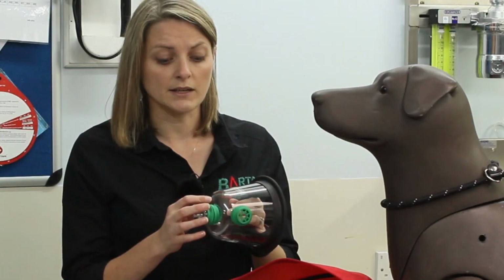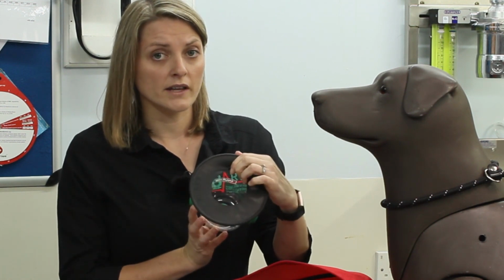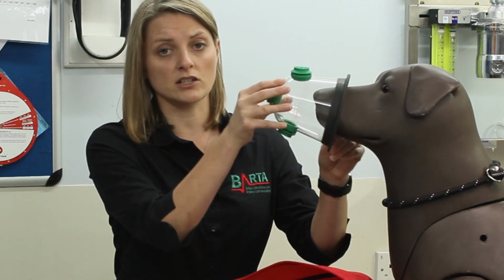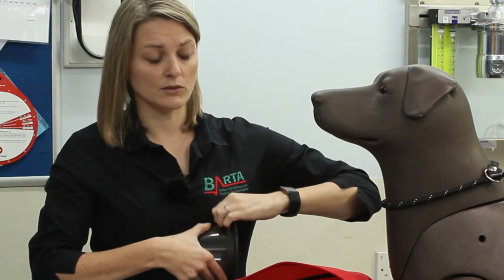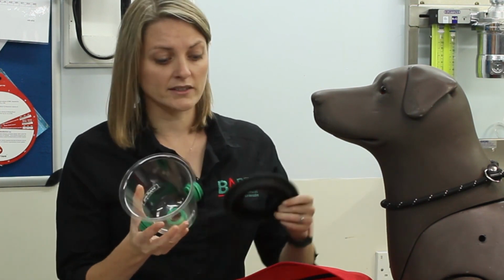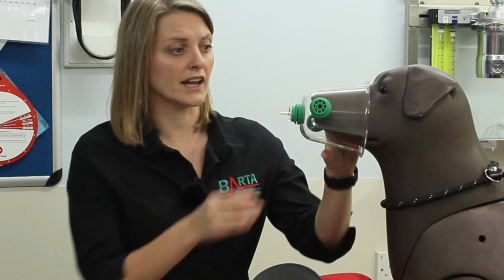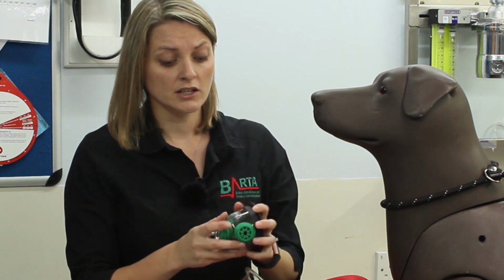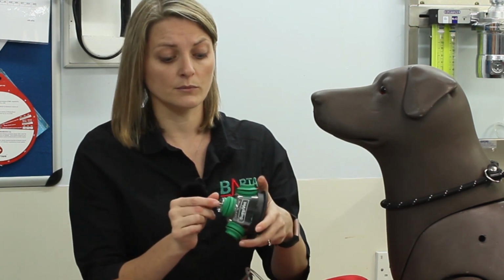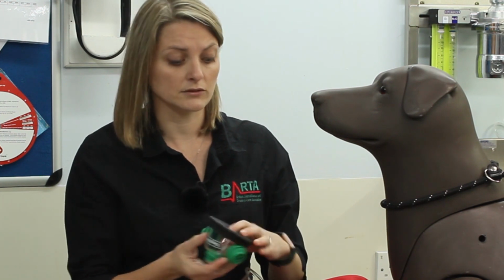So in an ideal world, the muzzle should fill the mask completely and should be as close to the oxygen supply as possible. Some animals require the seal, some do not. This dog here, you can see it's actually quite a tight fit, and he might find that quite uncomfortable if he's conscious. So you can easily remove the seal from the mask, and that makes a far more comfortable fit for the animal. We just want to get that as comfortable as possible. In smaller animals such as cats, or dogs which have a much smaller snout, things like pugs, you might actually find the shallower masks a better fit with or without the seal.